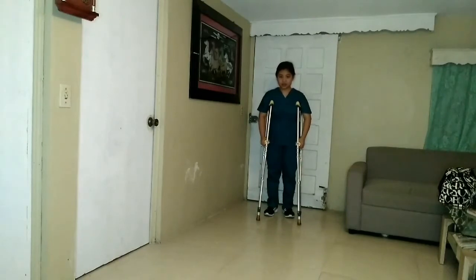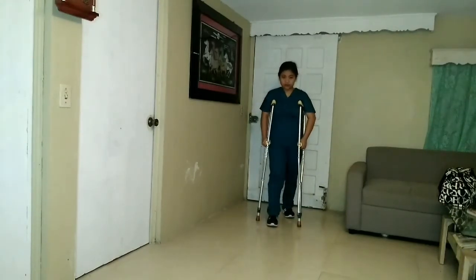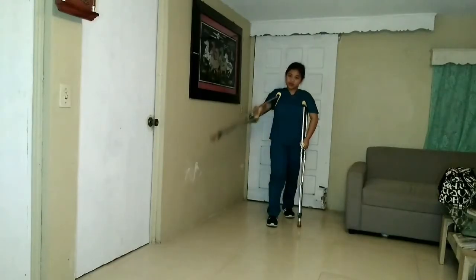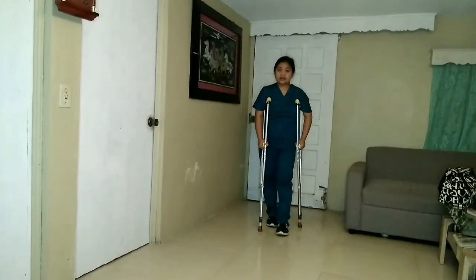Next, instruct our patient to use the 2-point gait. Begin with tripod position. Move the left crutch and your right foot. And then next, move the right crutch and your left foot. And repeat the sequence.